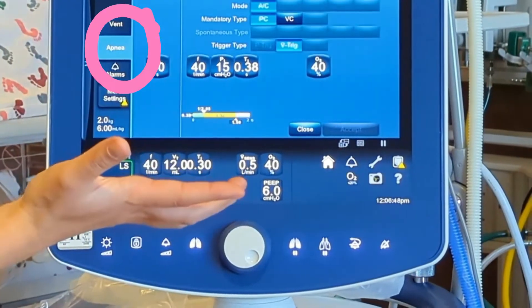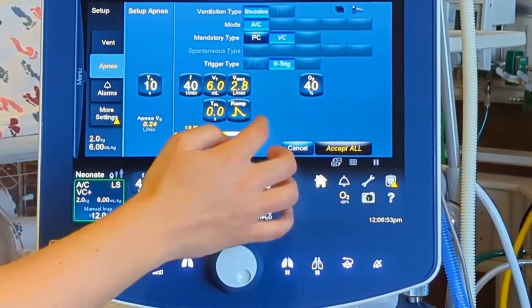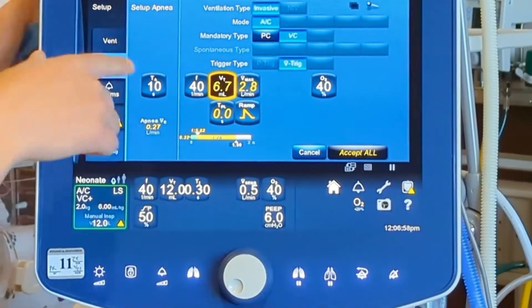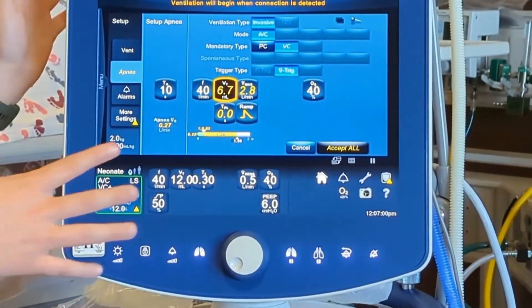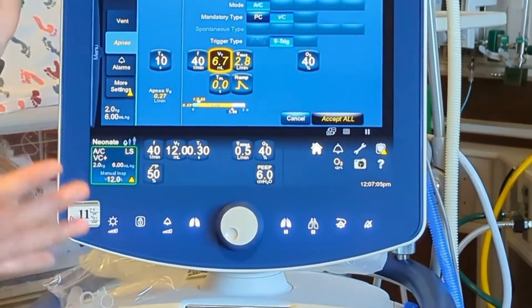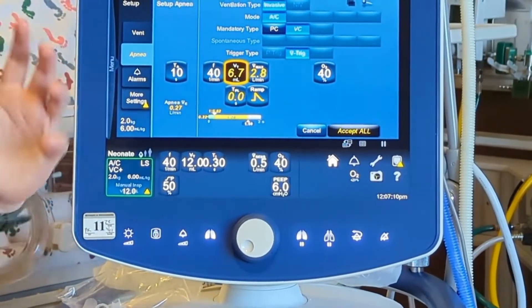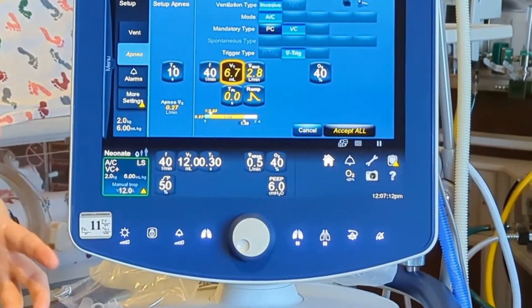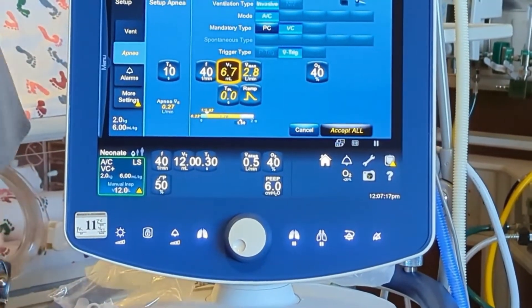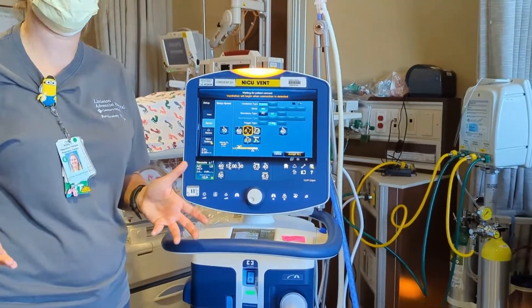Then we'll go into apnea. Our apnea settings, we try to match to everything we've set. Going to AC — VC plus. The main difference between VC and VC plus is that in plus, the baby can generate their own flow rate, whereas in VC you set the flow rate and the baby cannot manipulate that. So if they want a quick breath or a slow breath, they can do that.